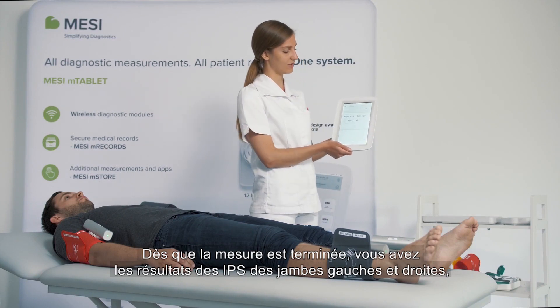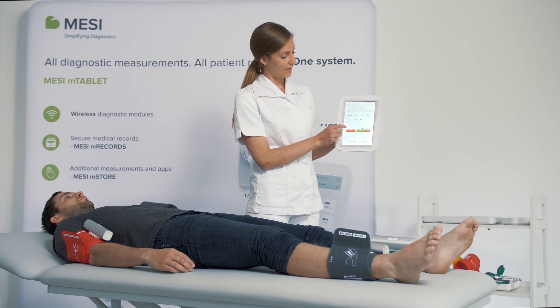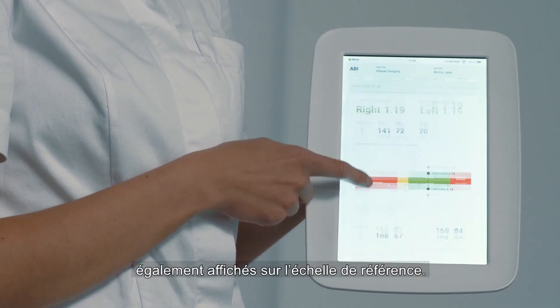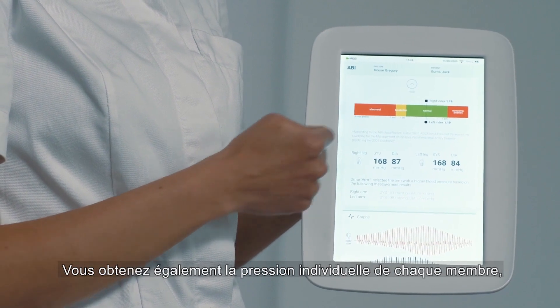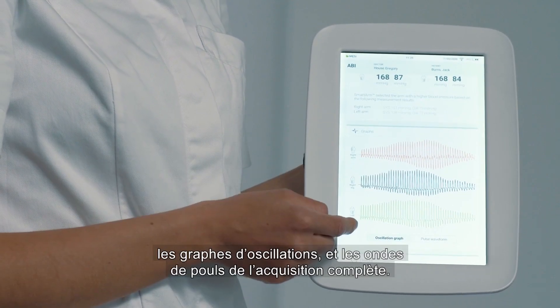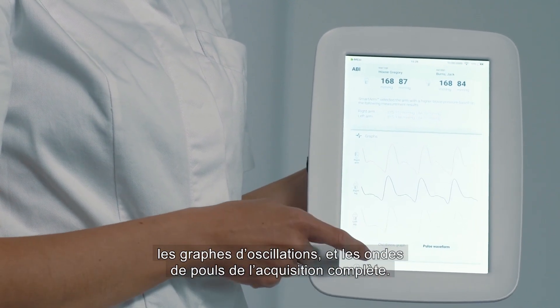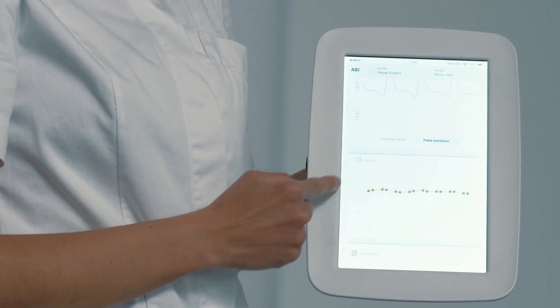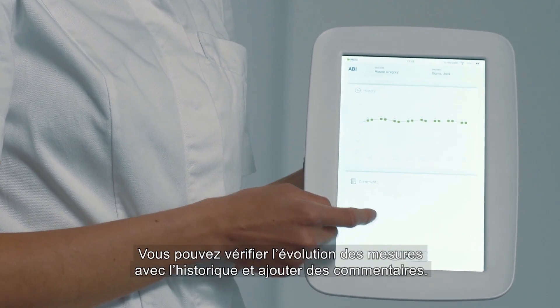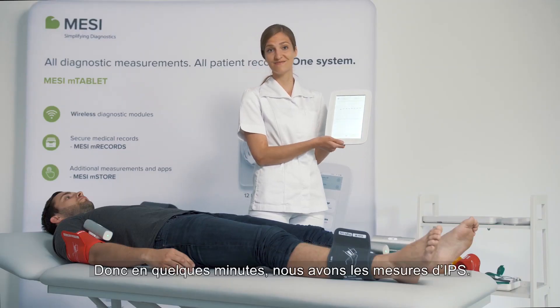Right away after the measurement is concluded, we receive the right and left ABI, and the calculation is put straight onto the PAD reference scale. You also receive the individual pressures for each extremity, the oscillation graphs for each channel, and the pulse waveform for the entire measurement. You can review the patient's history, monitor their trends, and add any comments. In a minute, you have your ABI.